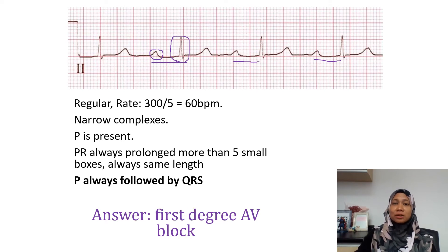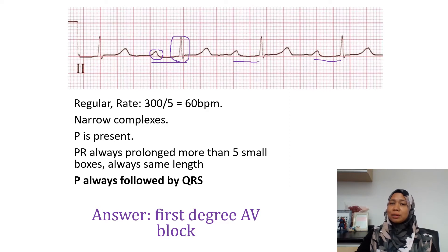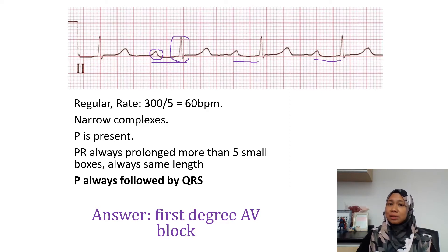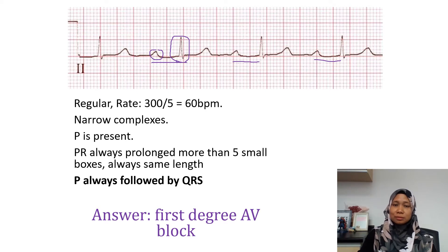So this is a first degree AV block. In first degree AV block, we can see that the PR is prolonged, but the P wave is always conducted — meaning that there are no dropped beats or missed beats.